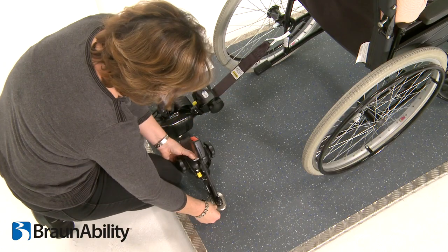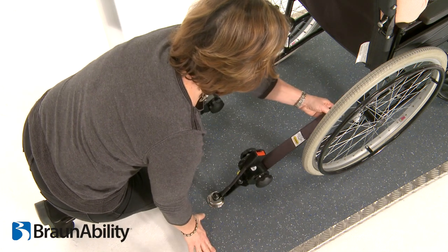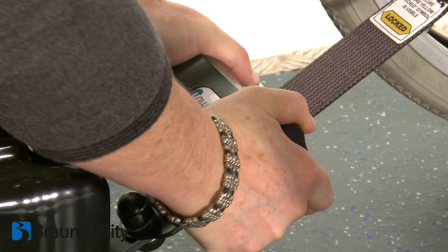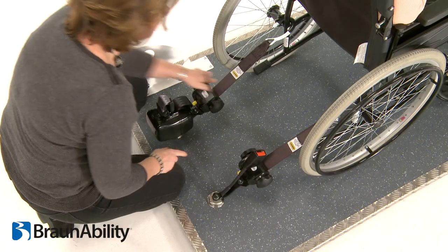Repeat the operation with the other Quattro Express unit. Final tensioning is achieved by turning the black handles towards the wheelchair unit until the webbing is equally taut on both sides. Ensure that the yellow positive locking labels are both clearly visible.